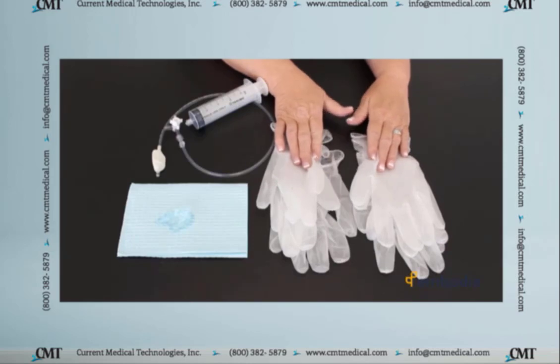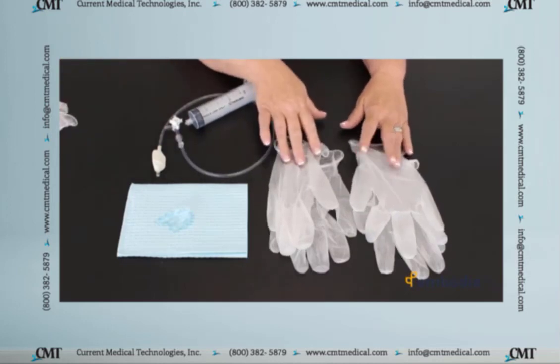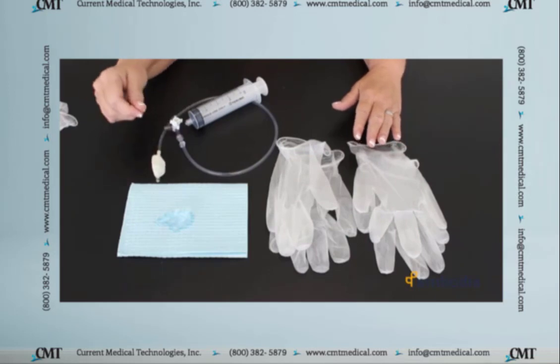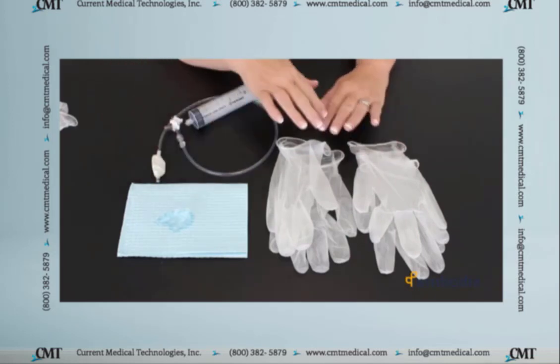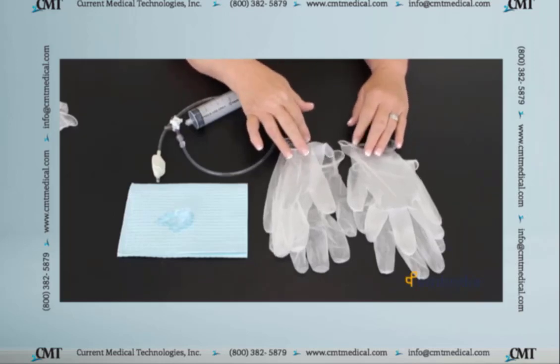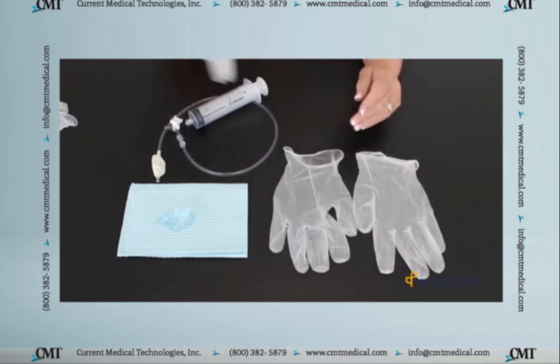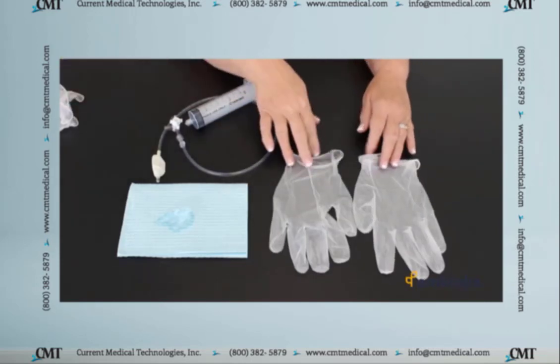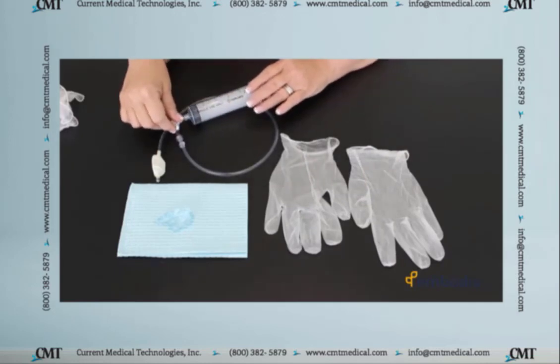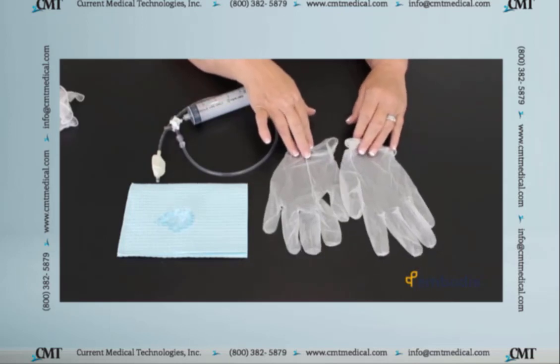After the rectal exam, you take off your first set of gloves. Now you're onto your second set of gloves, and it's time to put the condom over the catheter, put it into the lube, raise up their gluteal cheek, and insert the catheter in. Once you finish and get the catheter completely inserted, you're going to want to remove this pair of gloves. Now you have clean, dry gloves to be handling the syringe and the stopcock while you're actually doing the modality of the balloon catheter training.